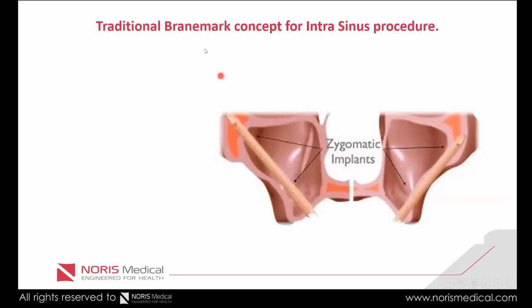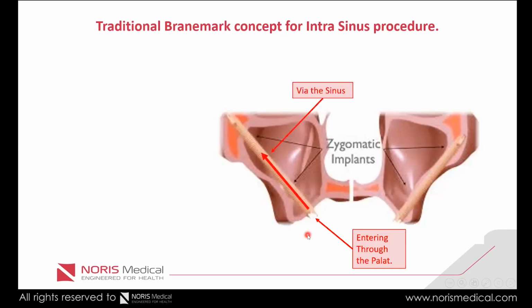So let's look at the traditional concept of intrasinus procedure. The implant was entered through the palate towards the zygoma bone, passing through the sinus.